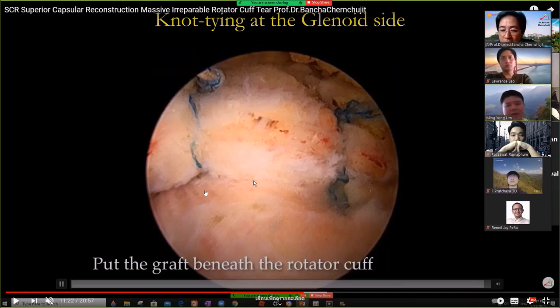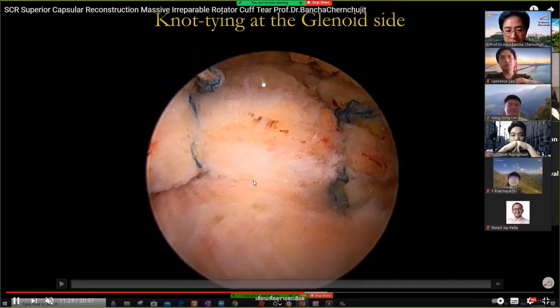After I repair my graft to the remnant of the supraspinatus, the cuff covers the graft on top. This promotes healing because you get vascular supply from the top via the remnant cuff and from the glenoid on the undersurface. The suture you're tying on the remnant is not sliding — you already tied the knot.